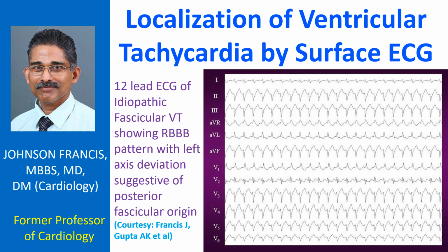Surface ECG can be used to identify the site of origin of ventricular tachycardia. QRS morphologic patterns and vectors are helpful in discerning the activation pattern of the myocardium. Chest wall deformity as well as metabolic and drug effects can sometimes cause limitations in analysis.